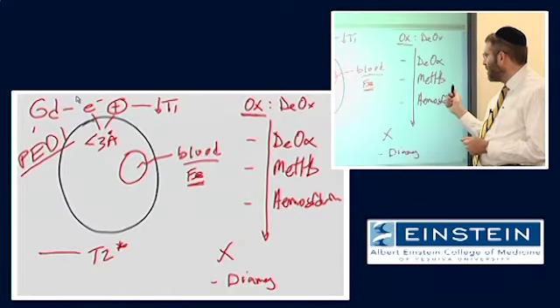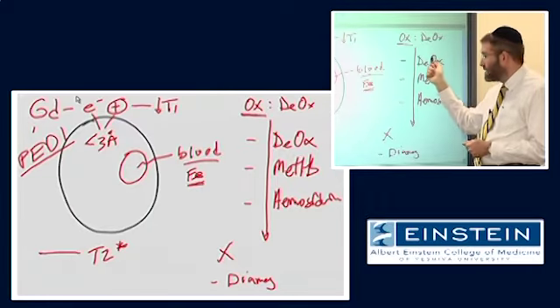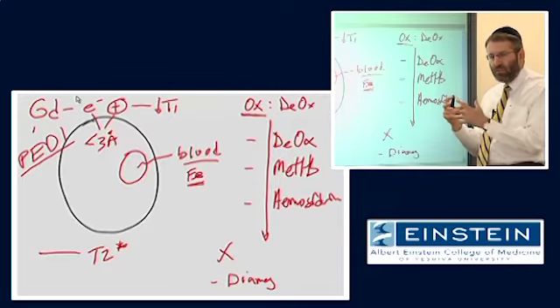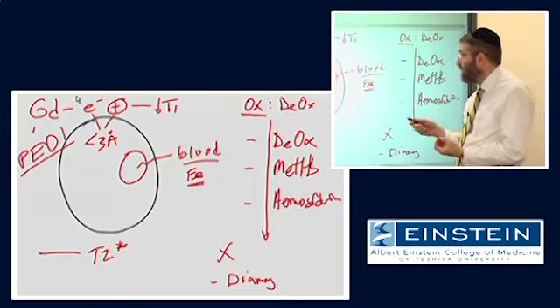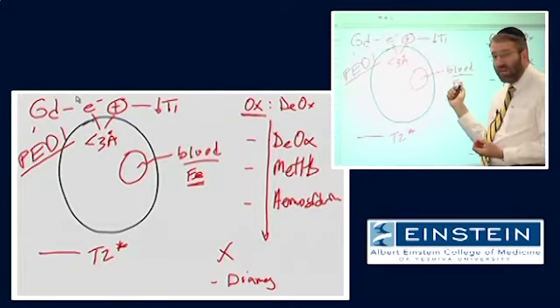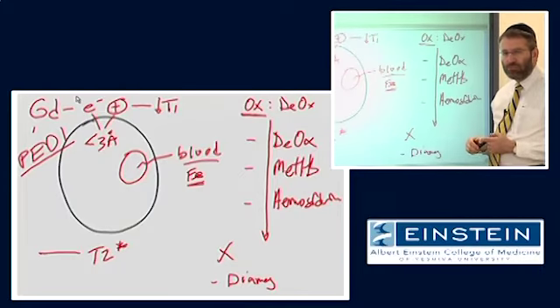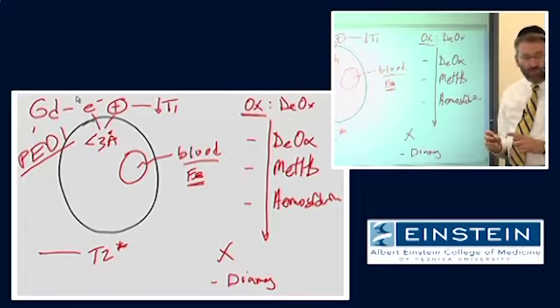So it turns out that it's only methemoglobin which, due to the conformation of the molecule, this change that occurs with the oxidation of deoxygenated to methemoglobin, that you have a hemoglobin molecule where the iron is exposed and able to have enough proximity to those iron electrons to undergo this proton-electron dipole interaction. Does it matter whether that hemoglobin is intracellular or extracellular? Not for that effect. We're going to get to that in a second.